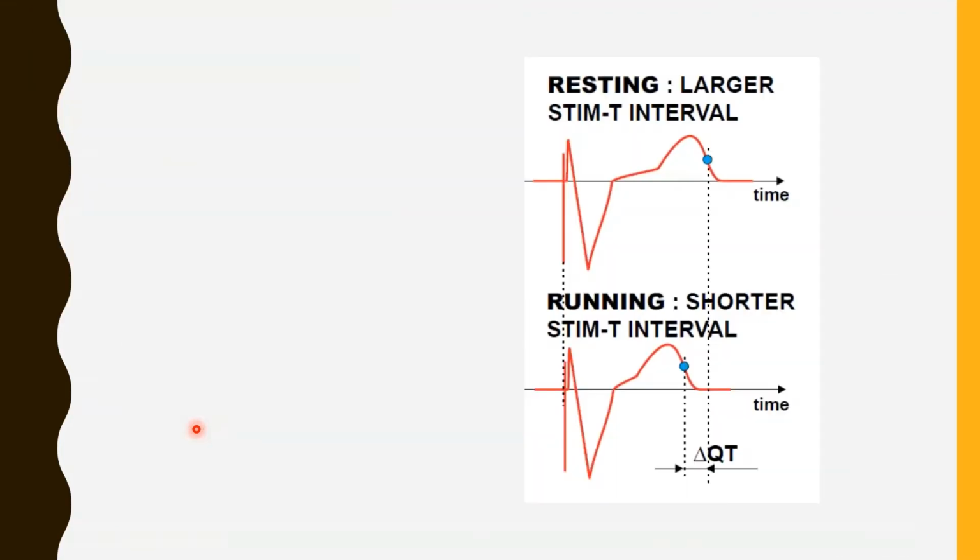So this is again, of course, one of the methods, or one of the physiological inputs to the pulse generator that allows the pacing rate to be increased based on the patient's needs. Because mind you, most of these patients we are implanting a pacemaker in had sinonodal dysfunction, they cannot increase the pacing rate itself without all these physiological or non-physiological inputs.